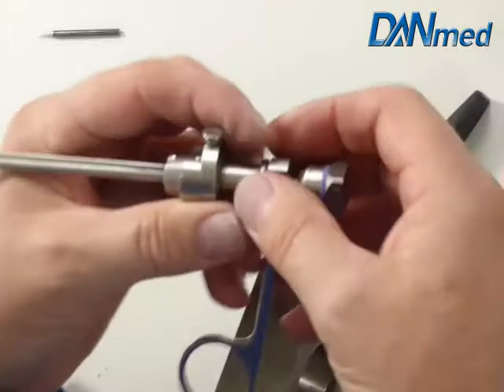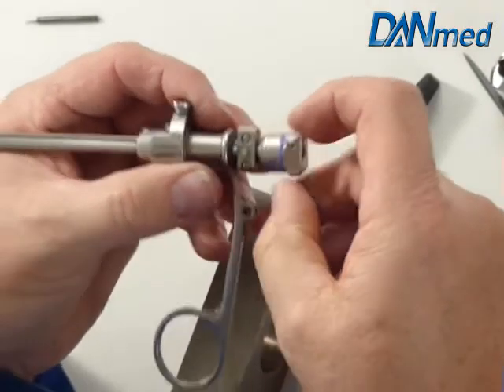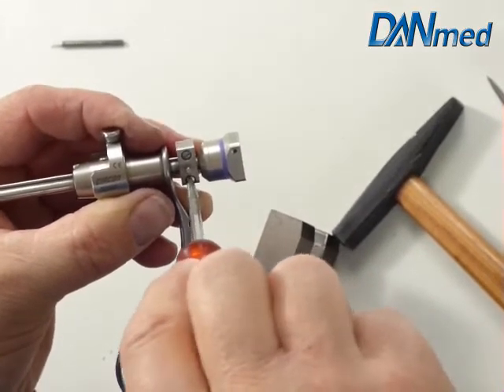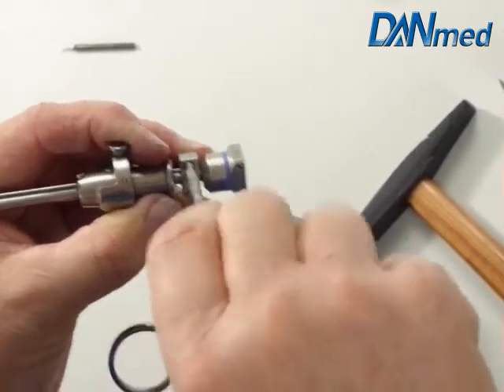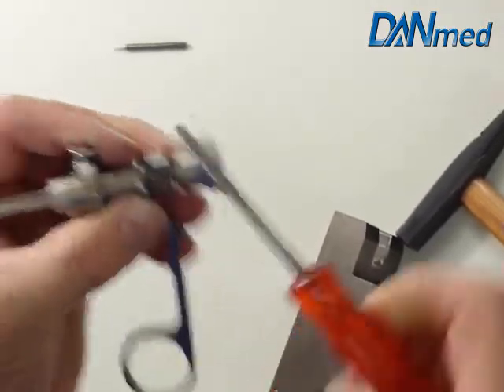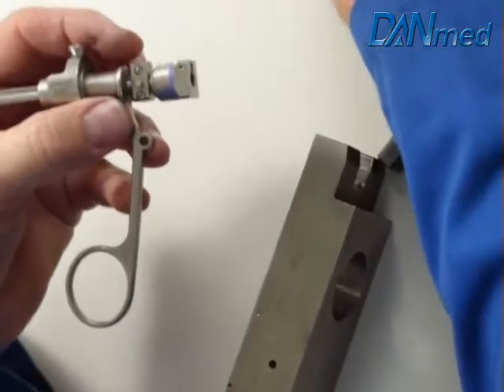Now we're going to adjust this end piece, this block on the inner stem on the drive rod. Check function.